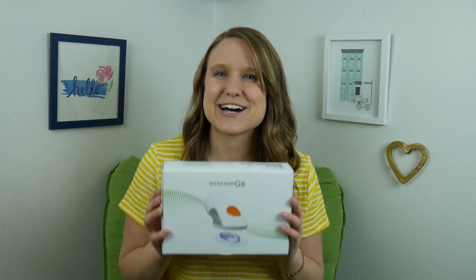Hey everyone, it's Diabank Danica and today I'm going to show you how to insert a Dexcom G6 sensor.